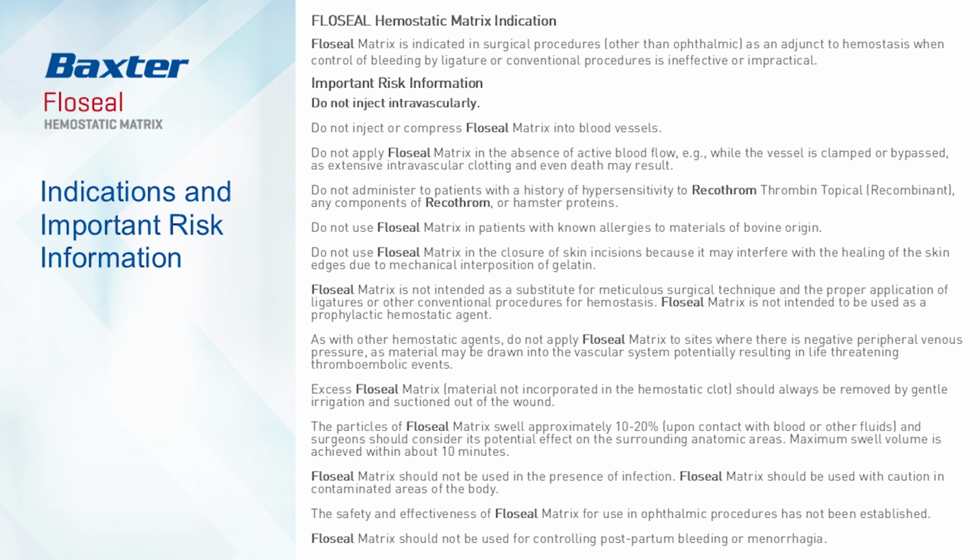FLOSEAL matrix is not intended as a substitute for meticulous surgical technique and the proper application of ligatures or other conventional procedures for hemostasis. FLOSEAL matrix is not intended to be used as a prophylactic hemostatic agent. As with other hemostatic agents, do not apply FLOSEAL matrix to sites where there is negative peripheral venous pressure, as material may be drawn into the vascular system, potentially resulting in life-threatening thromboembolic events.